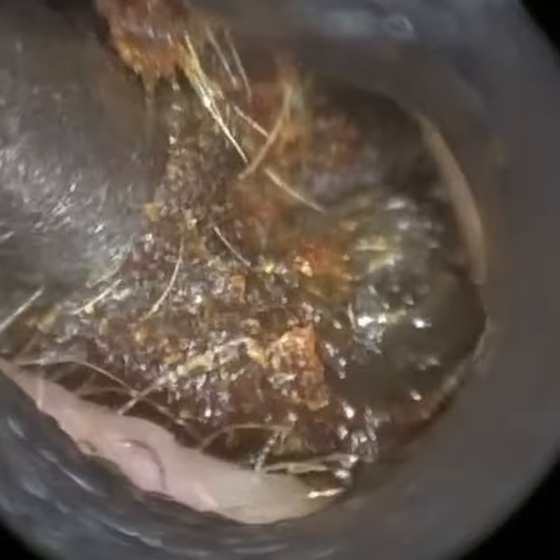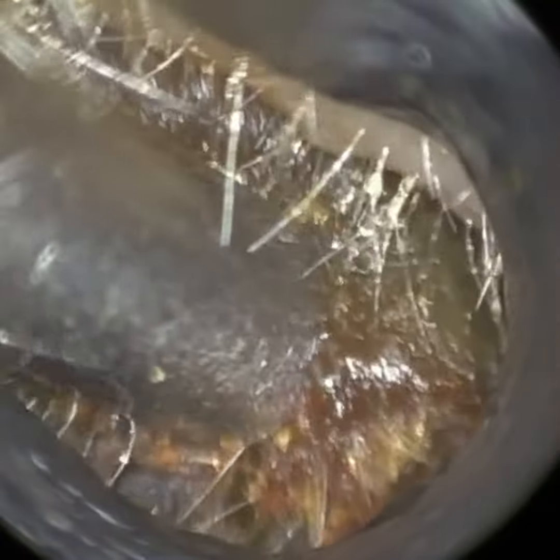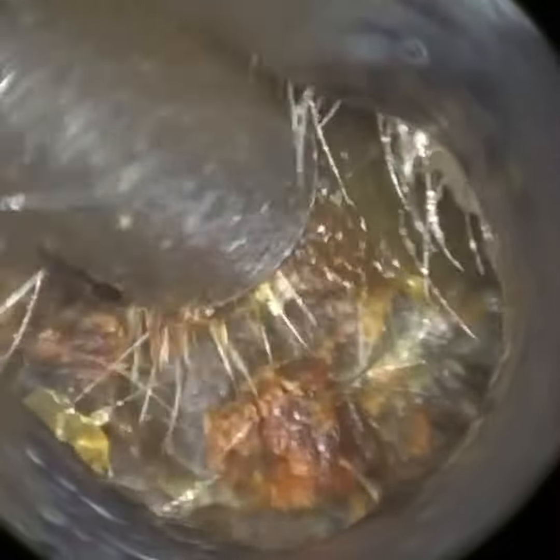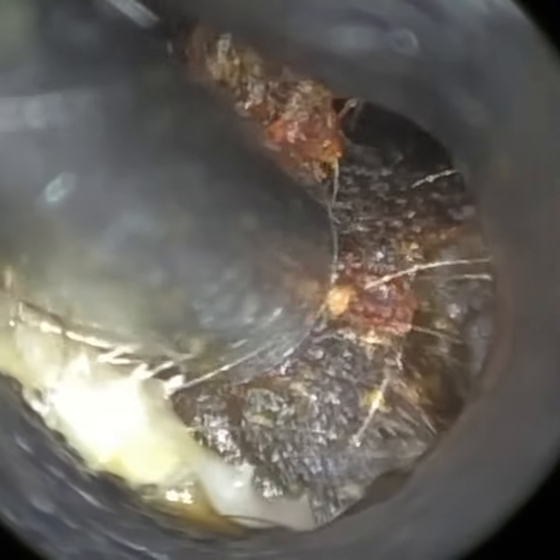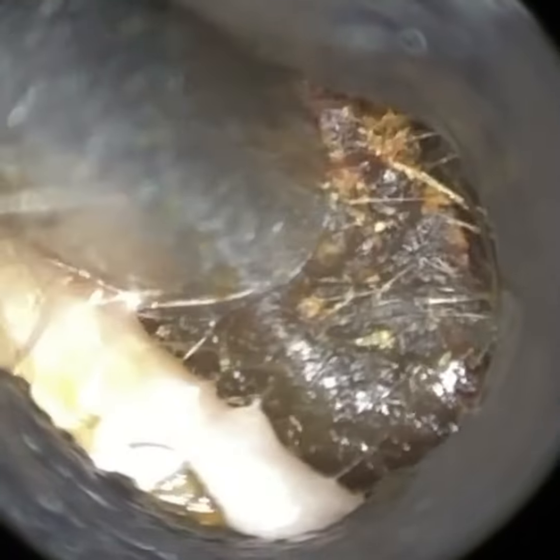With that first ear — the left ear — I don't think I could have removed that with suction alone; it would have been quite a long procedure. That's where the hook did assist. What can be a bit easier with the Waxscope is when you're using mechanical instruments — by which I mean the ear hook, Jobson Horne, or forceps — because you're straightening the ear canal using the speculum and you get a clear line of sight. So you can possibly go in a bit deeper with the hook confidently. With an endoscope it's a bit trickier to get past the second bend, but with the Waxscope it's probably a tad easier.